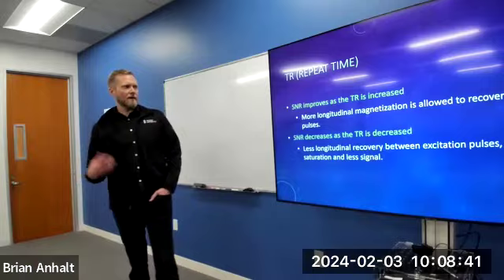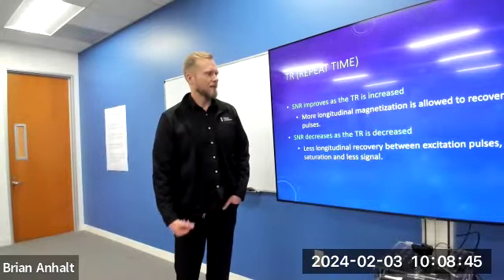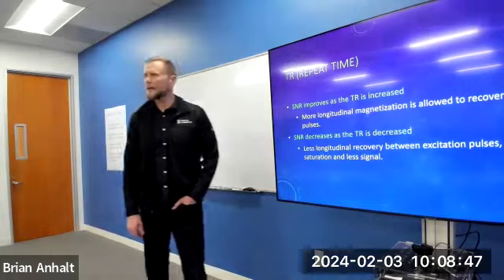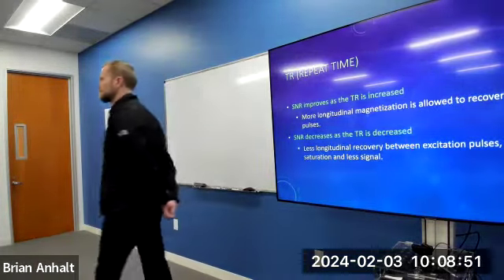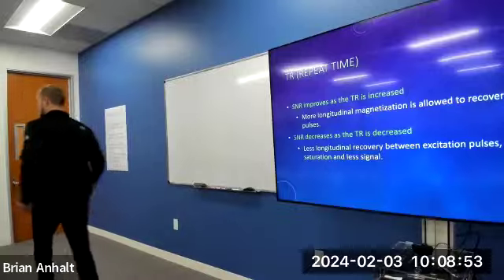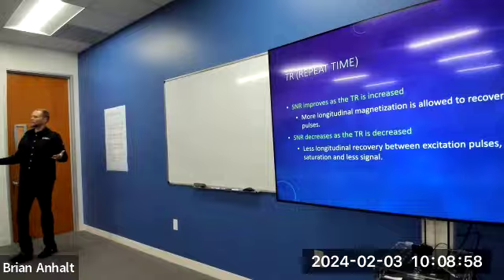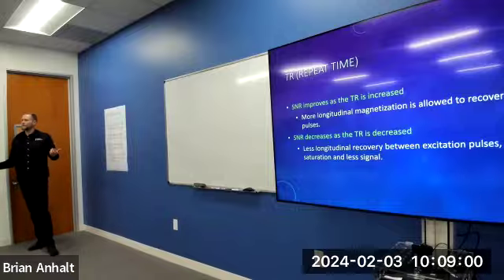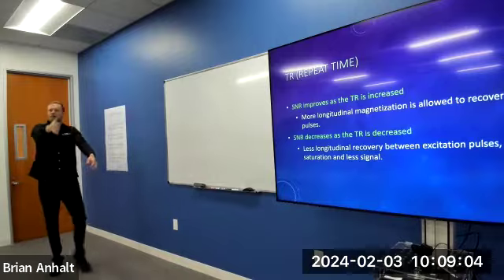But how is SNR affected by TR? If our TR is increased, what happens to our SNR? It increases, right? Why? Because we're allowing for full longitudinal recovery, right? Basically like starting off at equilibrium every time because we're waiting for everything to fully recover back.